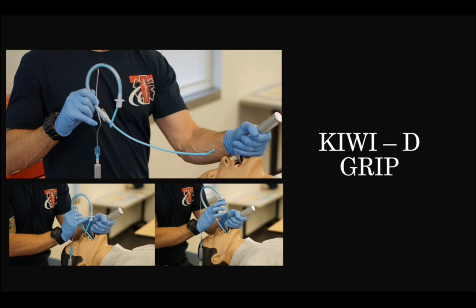Another way that you can do it is by preloading. Preloading with a Kiwi D grip is one that people like. We'll practice this in the breakout sessions because some people love this and for some people it doesn't work as well. The benefit is that you don't need a partner to help you with the bougie if you have it preloaded in this fashion. The downside is you don't have enough bougie in front of you to necessarily feel hold up, and you may not feel the tracheal rings through the ET tube.